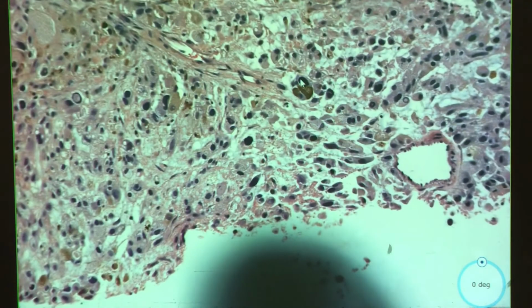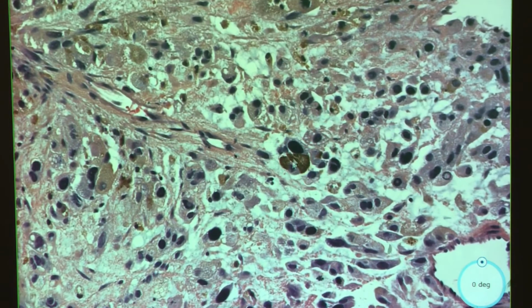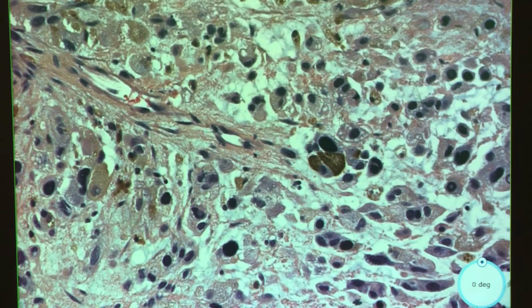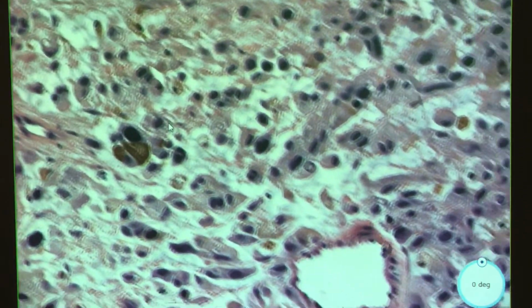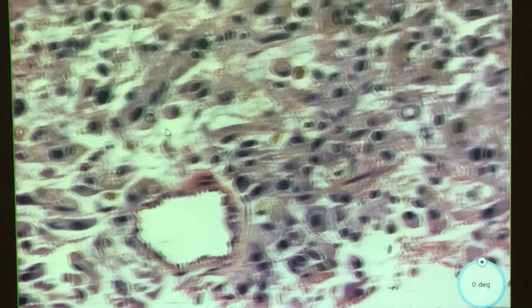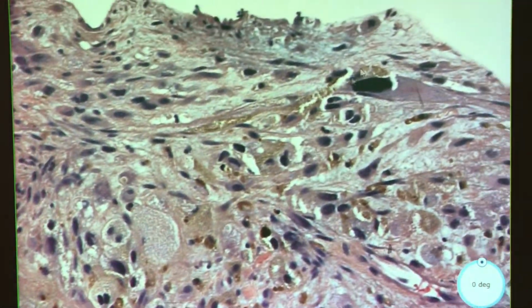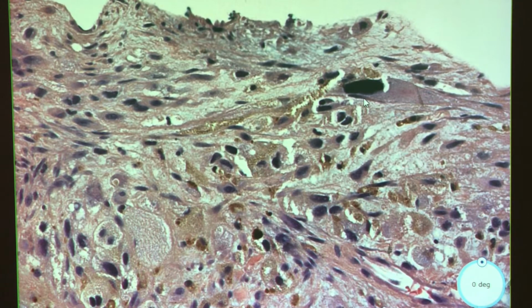All right, let's go up to their dots and see what they dotted. Oh my gosh, it's even crazier. And look how prominent this pigmentation is. Okay, there can be no doubt with this. This has to be melanoma. There really aren't other lesions in the breast that are going to have pigmentation like this. These wild nuclei. Oh my gosh, way too crazy.